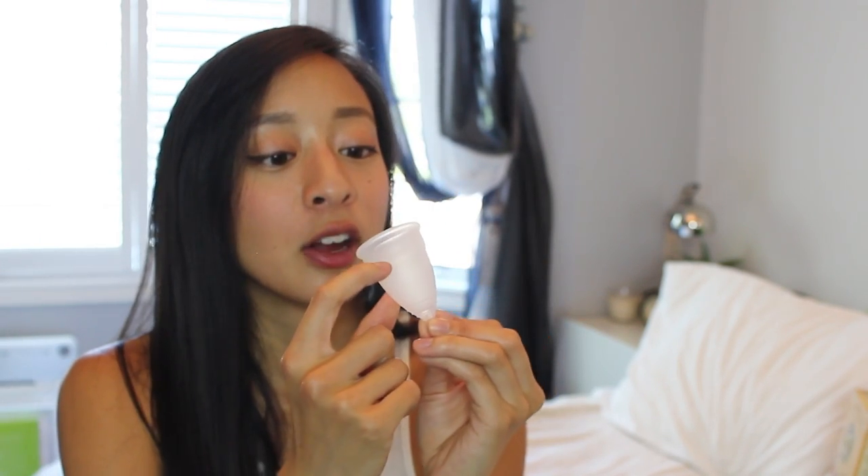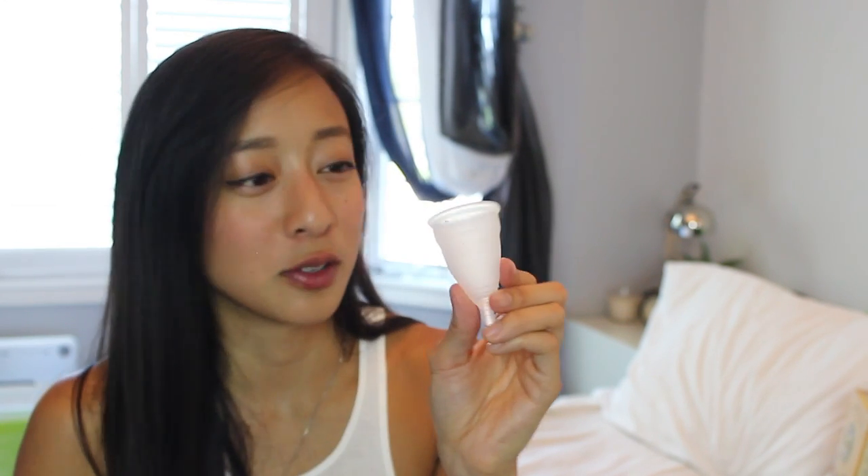And the next thing is the actual cup. Oh my God, this is so weird. Whoa, oh my gosh — it has like a measuring line. So right here would be a quarter of an ounce, and right here would be half an ounce. That's half a shot, guys. That's gross — I shouldn't have said that.